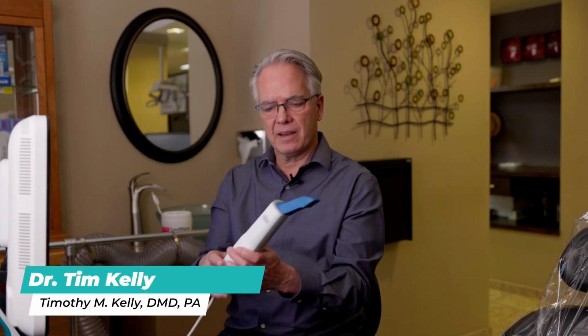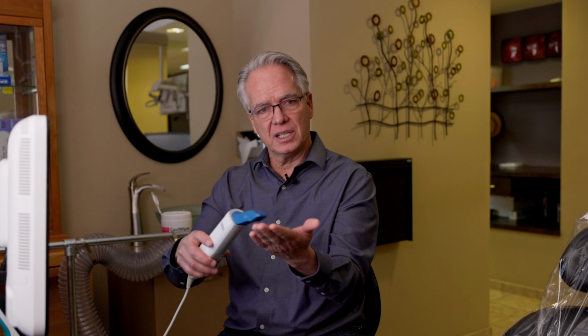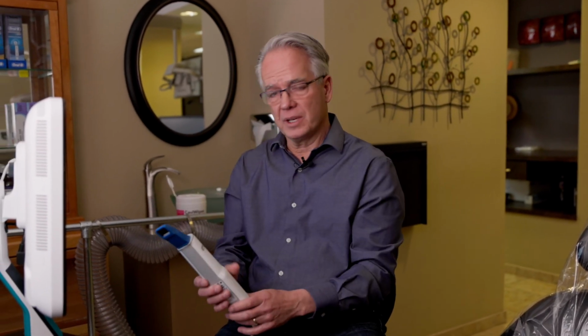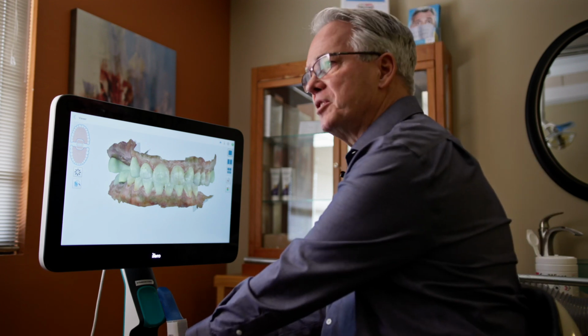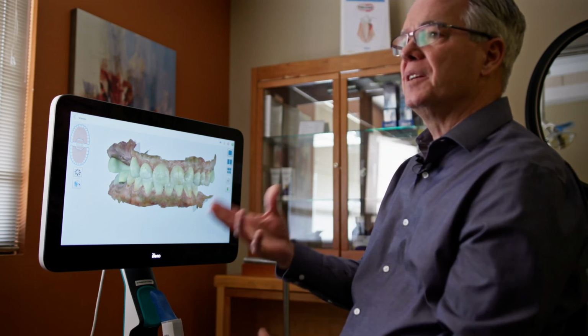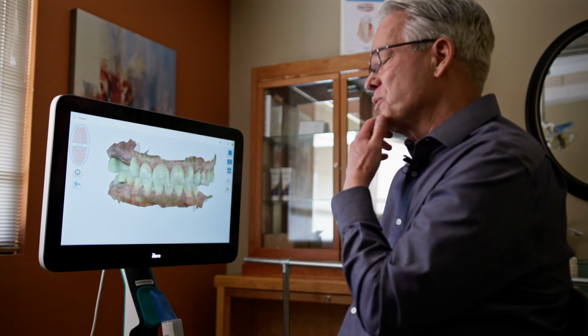This is our iTero scanner, and the reason it's called a scanner is because we have this wand. It's not turned on right now, but it's lit, and when we go over the teeth, it takes the video image and loads it into our scanner. Once that is done, it takes maybe 15 or 20 seconds to scan the entire mouth and get images of the teeth on the screen. It's really a wonderful tool.